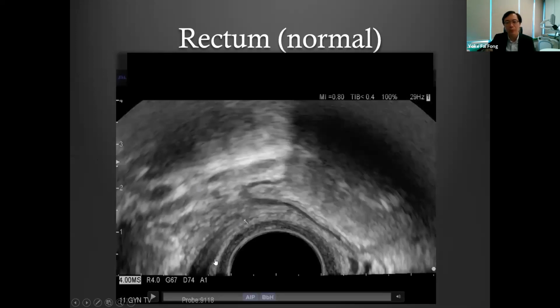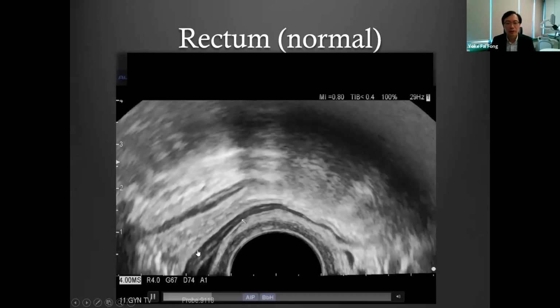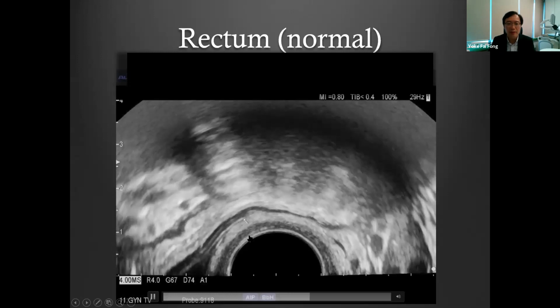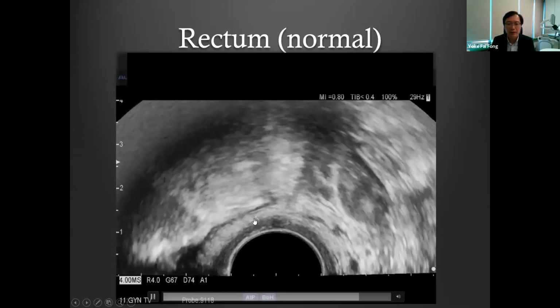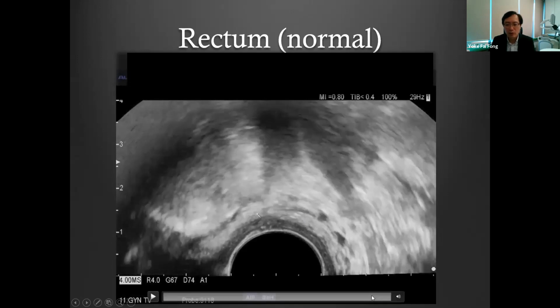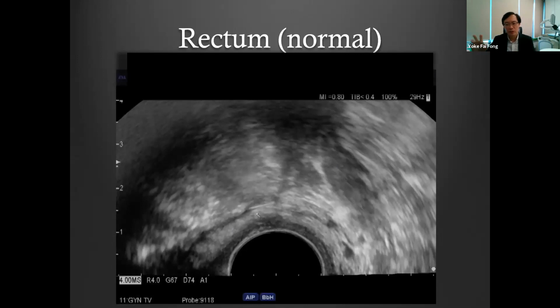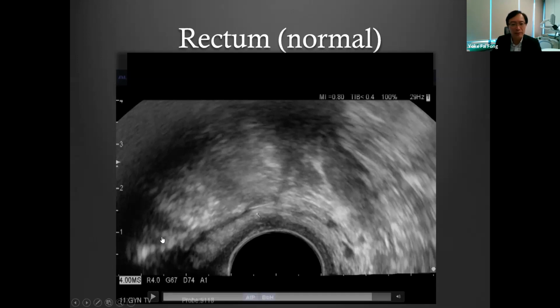Okay. So next one, I'm actually going upwards higher up, towards the uterosacral ligament and beyond. Again, you can see the white, black, white, then black inside. You can see these few layers over here. If you look over here, this is the ovary over here. I'm tracing the rectum up to the left ovary. So by the time you can see the left ovary, you are near the sigmoid or at the sigmoid junction already. So it means that you can actually trace the whole rectum from lower rectum, mid rectum, upper rectum, and up to the sigmoid even. Okay, I'll show you again.